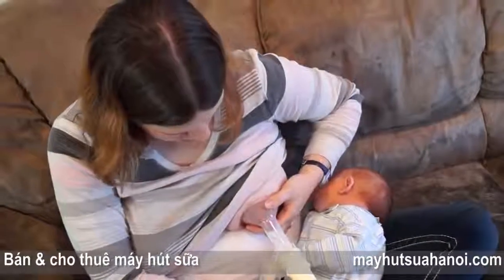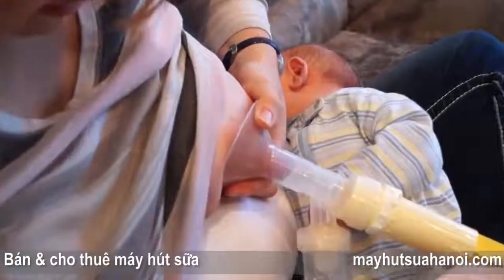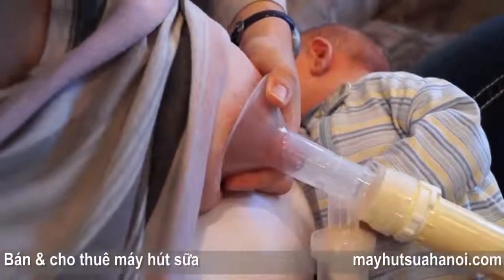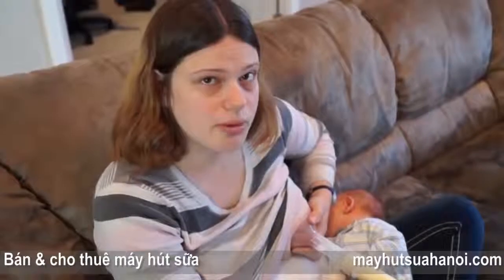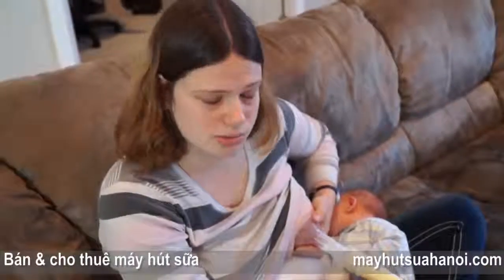Oh, the other side is flowing nicely. Look at that. Baby got the letdown for me, and I'm taking over. He fell asleep. You may find that one side is more responsive for the pump than the other. You may find that one side feels fuller than the other. That's all normal.